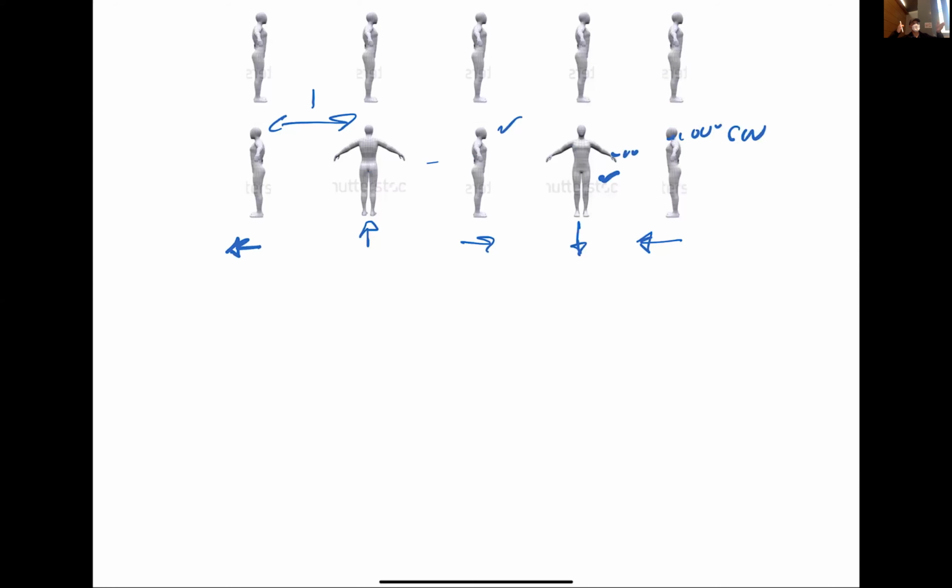Okay, so that's a key. When we're talking about period, we're saying, if I see a spin pointing this way, how far do I have to go before I see another spin pointing the same direction? And that's the period. So that's a spatial period of 4 here.